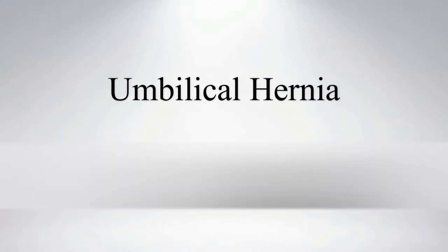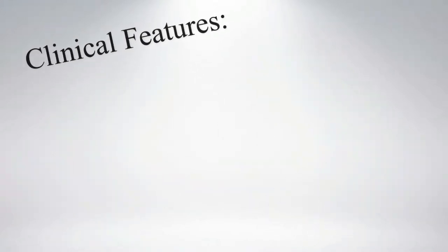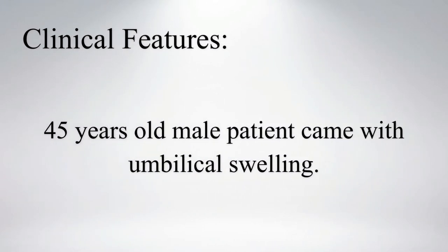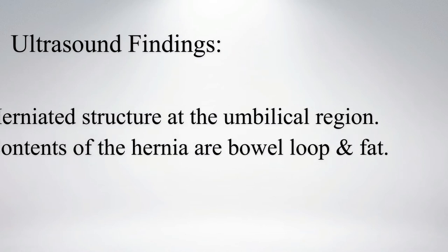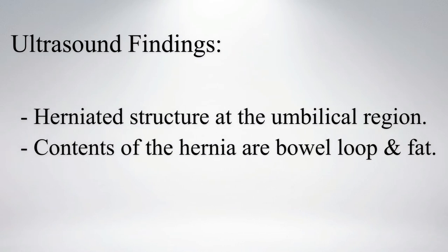Hi everyone, let's see a case of umbilical hernia. A forty-five-year-old male patient came with a swelling at the umbilical region. On ultrasound, a herniated structure is noted at the umbilical region. The contents of the hernia are bowel loop and fat.